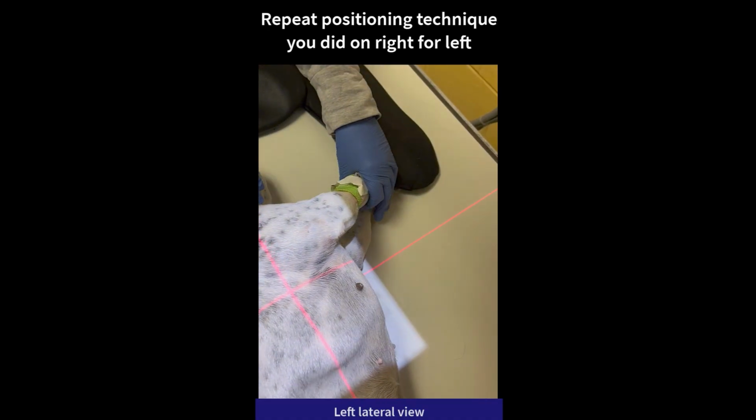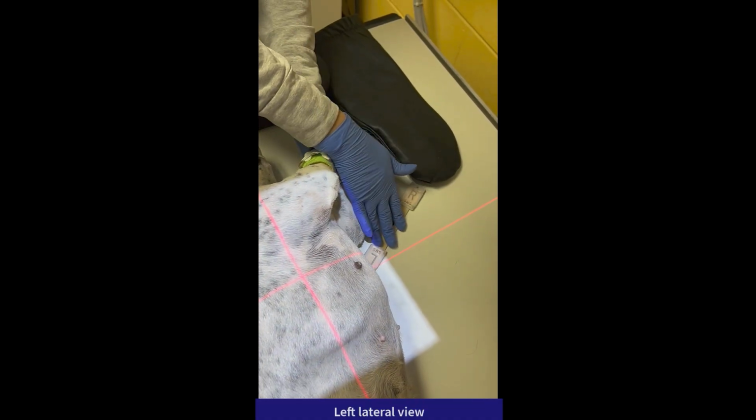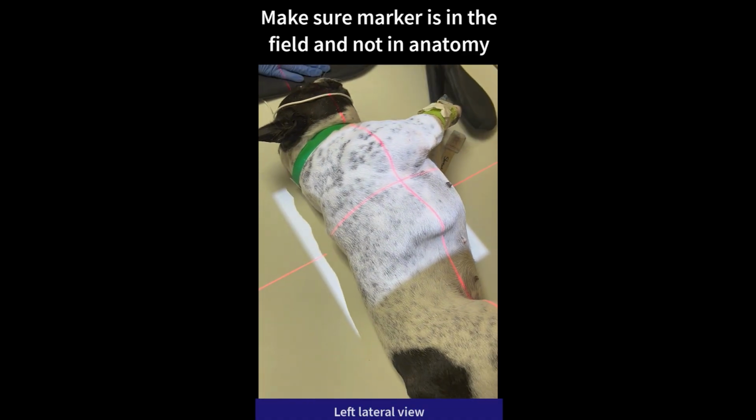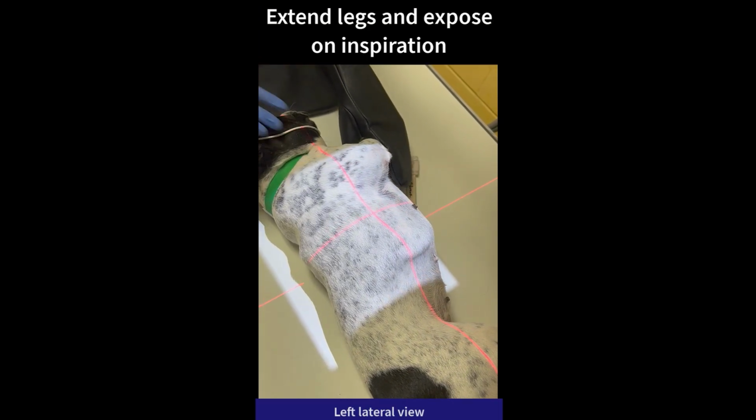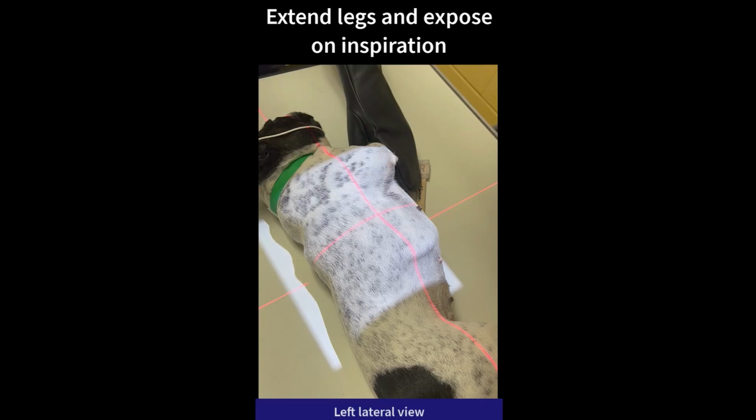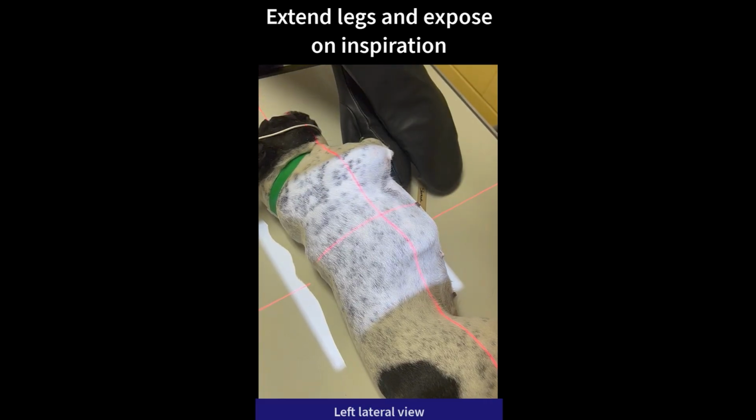Ensure the appropriate marker, left marker, is within the field of view and not superimposed over the relevant anatomy. Extend the forelimbs cranially and acquire the radiograph during the inspiratory phase.